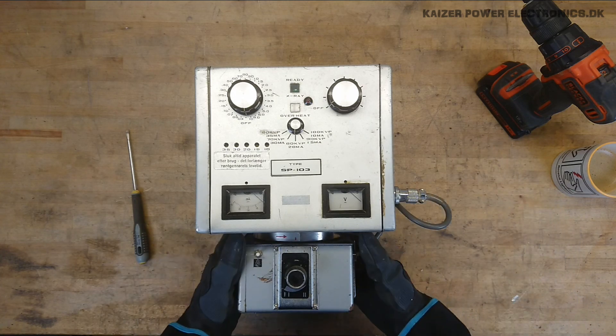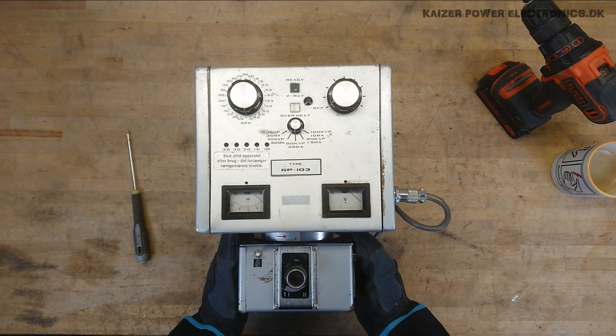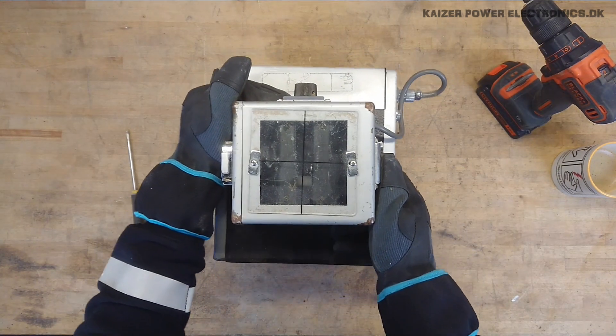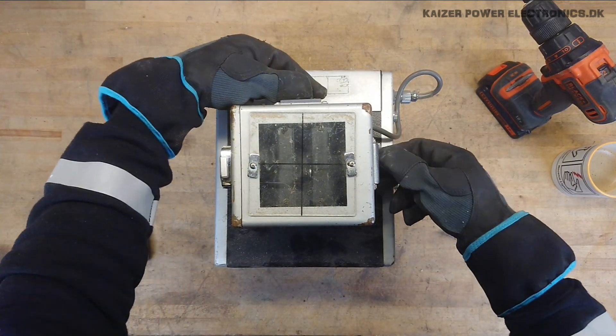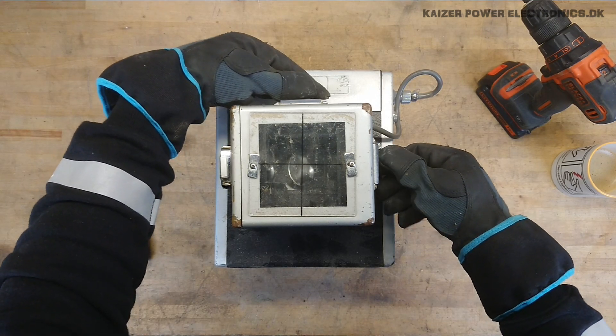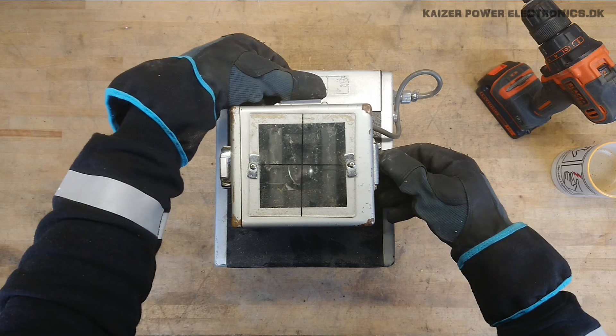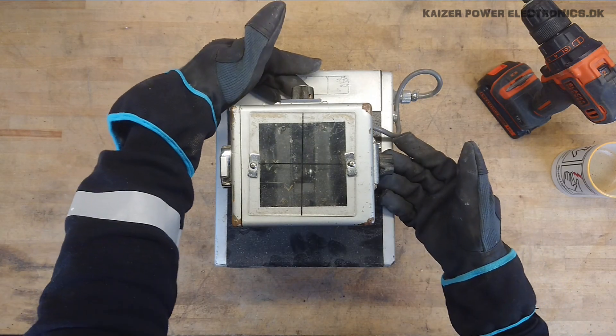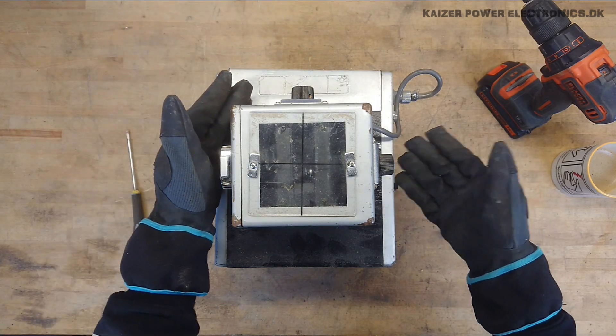Underneath we have the collimator. The collimator is the beam shaping device. If we look at the moving parts inside here, it's simply just setting the aperture of the beam — to narrow down how much radiation you're going to give the patient outside the area you want to take a picture of.